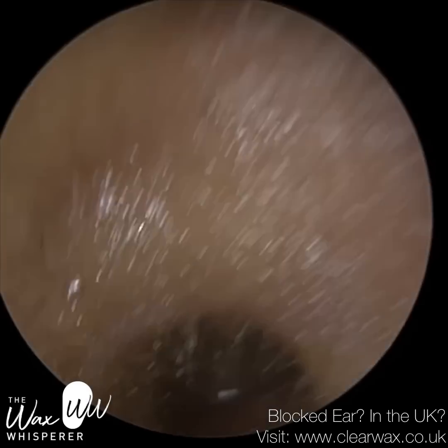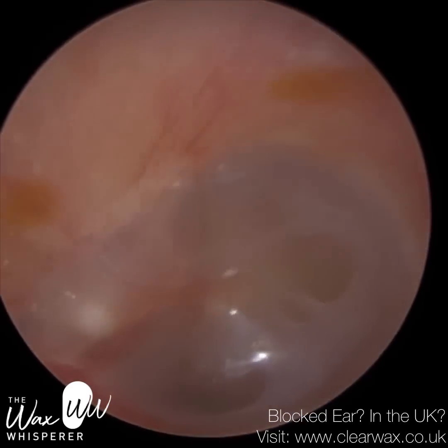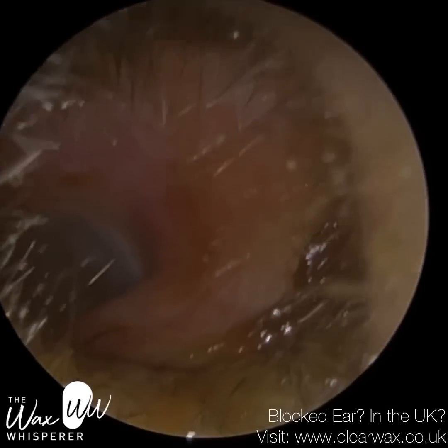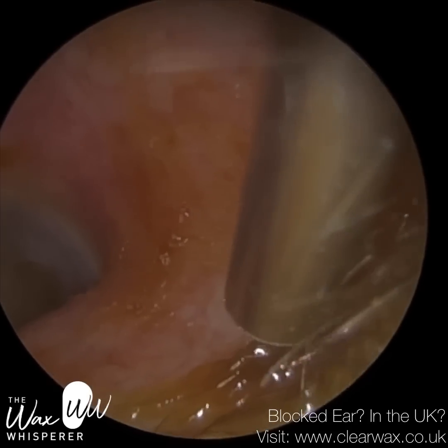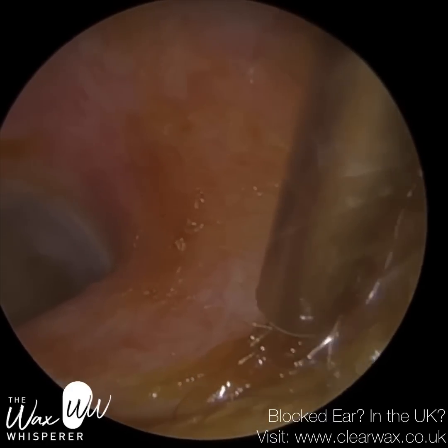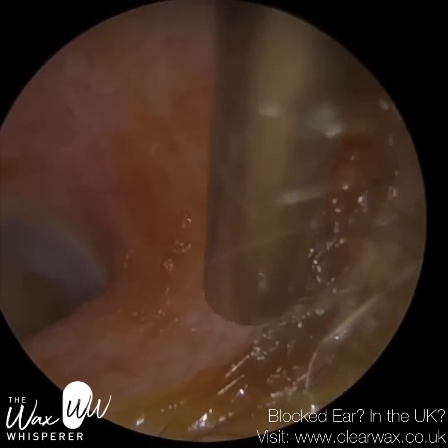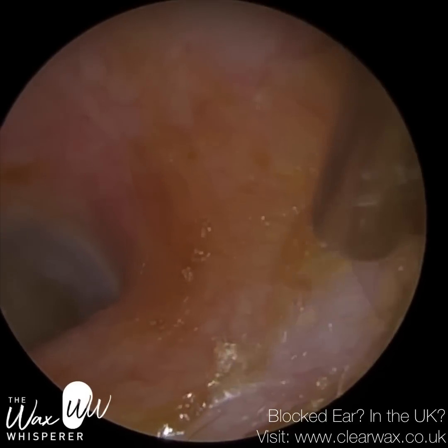There we are. You can tell by the colour on both sides it's quite dark, so it's oxidised, it's been there for a while. The patient last attended in 2018, so it's a good 5 years. And it does vary from individual to individual. If you are one of the 5 to 10% of the population that suffer from earwax, it generally is a condition that is chronic. So what I mean by that is you'll have to have it removed repeatedly over the years, and the frequency at which you need it removed is dependent upon the individual.